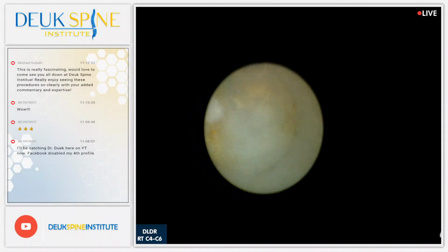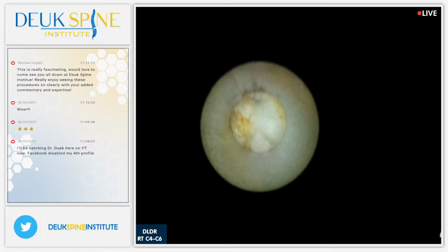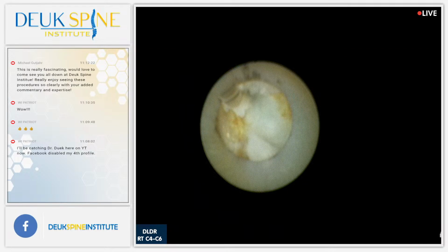There's the tear right there. You guys see it? Man, I'm feeling dripping all over my foot. You need something on this hand. Give me a Raytech on this hand. Should be fine, Sam? No, there's nothing wrong with the suction. It's the water dripping from my wrist to my foot, past the bag.